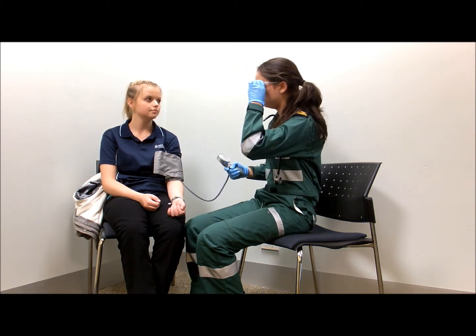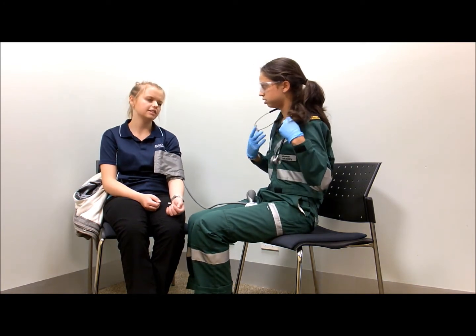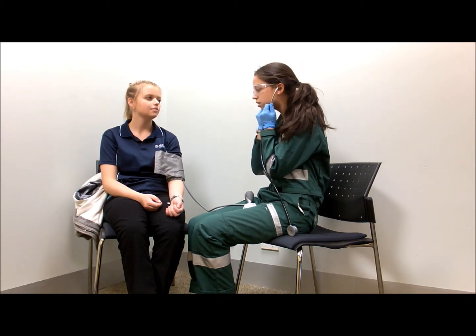Blood pressure seems to be normal so far. You've got relatively normal blood pressure? Yeah, I think so. My doctor says I'm pretty good. It seems pretty good so far. So I'm just going to have another listen. Yeah.